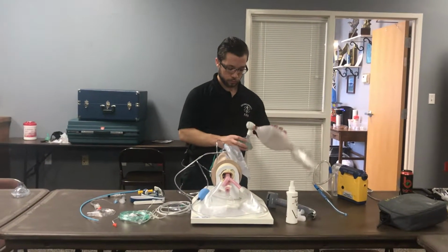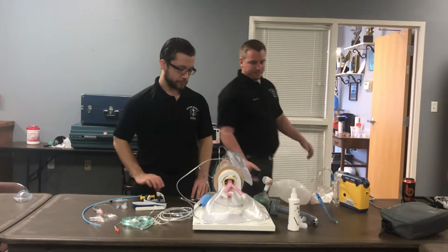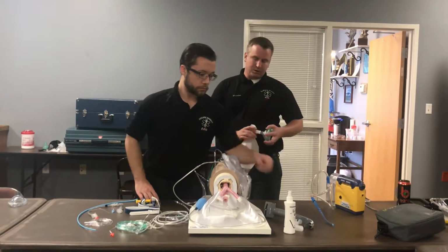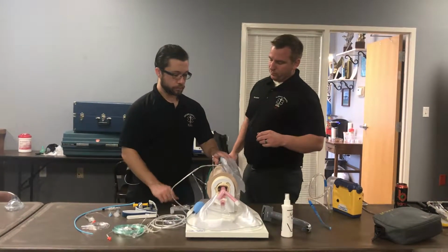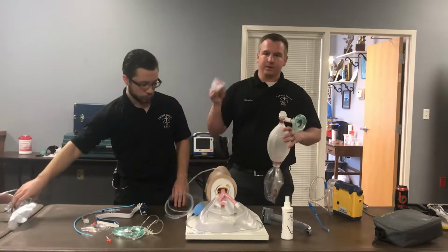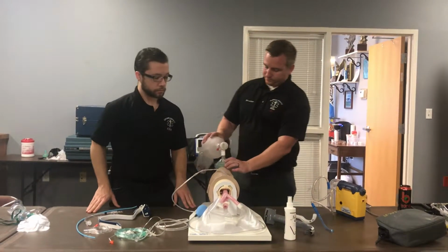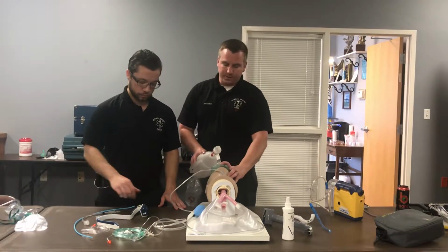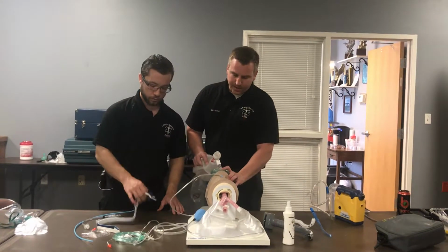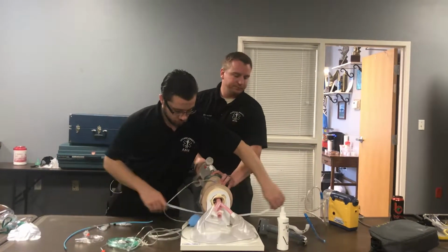I am Levi's EMT partner, and so he has given that, so obviously the respiratory drive on this patient is gone. We would insert an OPA. This OPA that we have here is obviously way too big, so we are going to verbalize the fact that that is inserted. I'm going to bag. Levi is going to bump that nasal cannula up to 15. I'm going to bag with a good CE clamp as Levi's setting up for intubation.